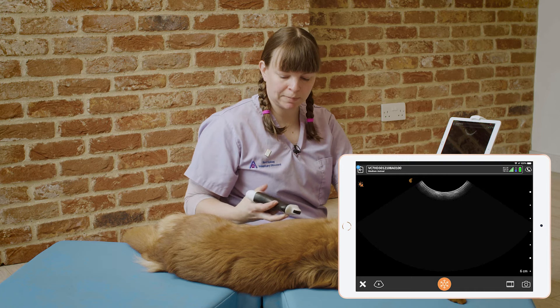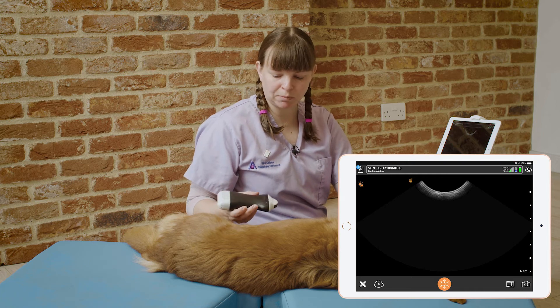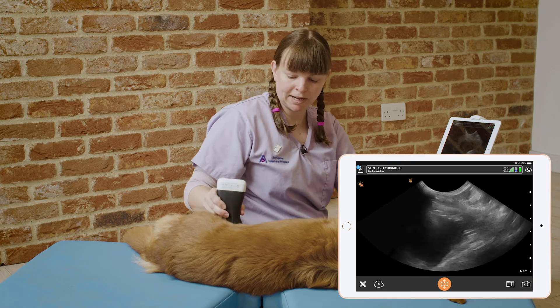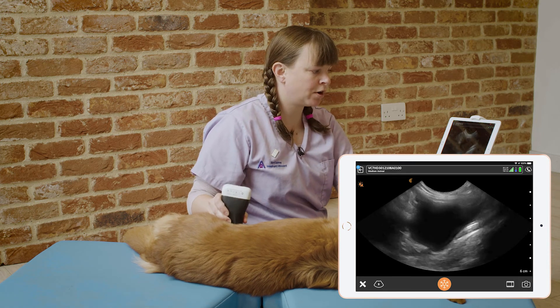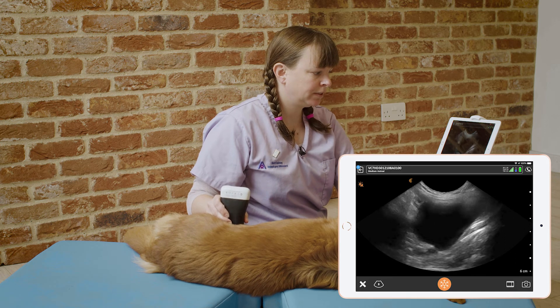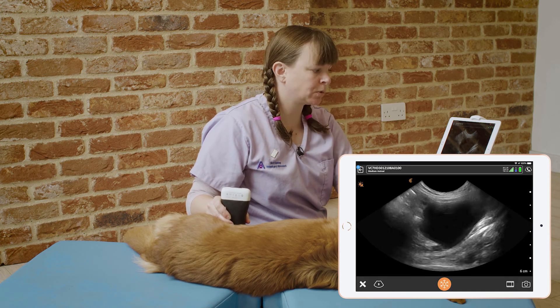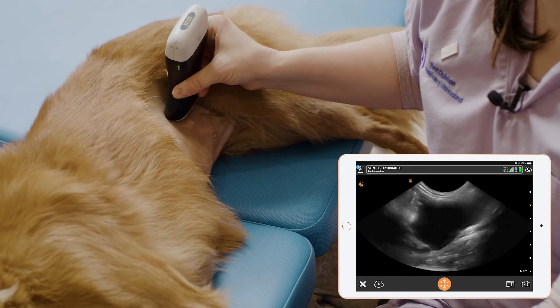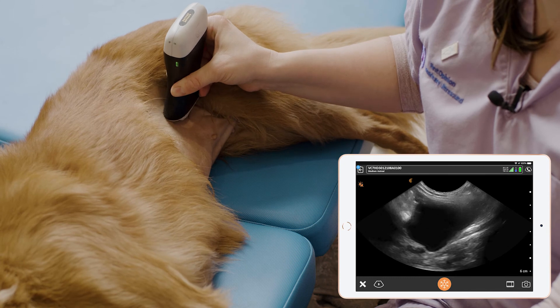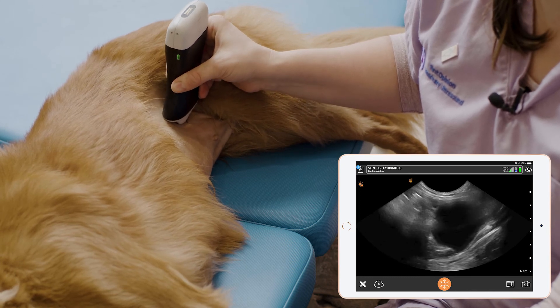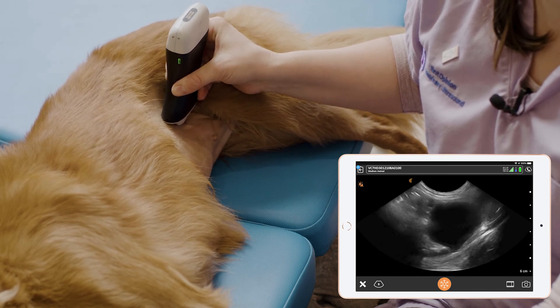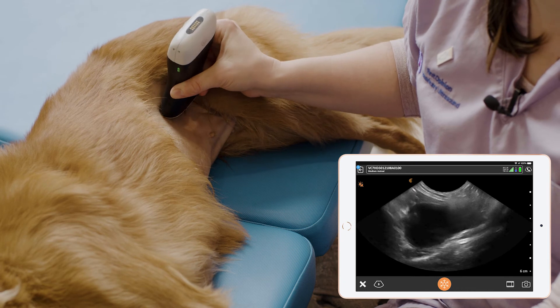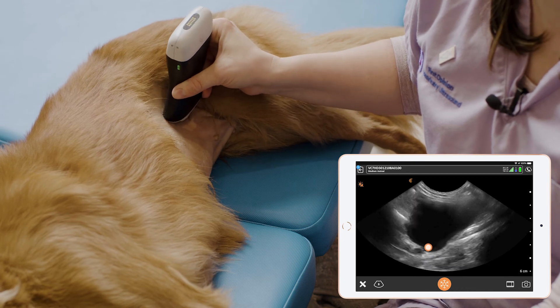Finally, with the bladder it's always important to get a dependent view. We place the probe looking through the bladder down towards the table, and we'll see the gravity-dependent view where we'll see any stones or sediment that's fallen to the dependent side.